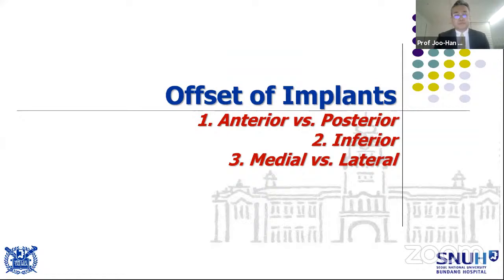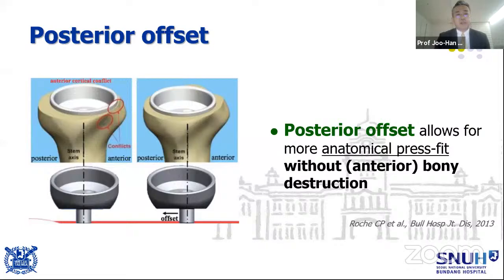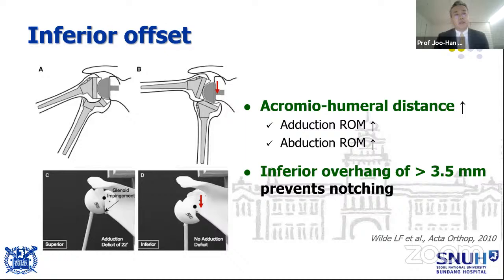My major talk tonight is the offset of the implants. Sometimes we need anterior offset to give more teres minor tensioning, or sometimes posterior offset in patients with anterior bony deficiency and so on. But probably many of you usually use the inferior offset to give more acromio-humeral distance, more deltoid lengthening, or to prevent scapular notching.